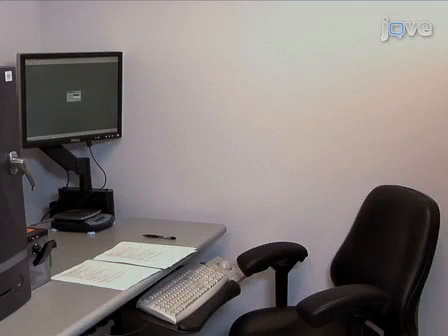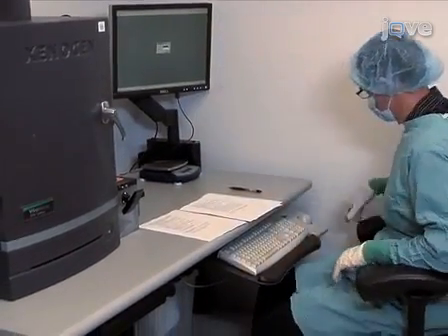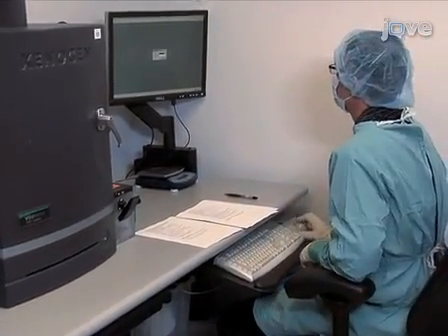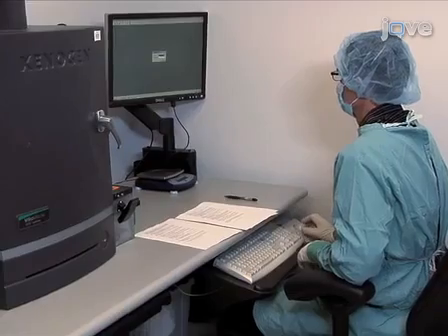Beginning 1 week after the tumor cell injection, quantitative bioluminescence imaging, or QBLI, should be performed once or twice a week. Here, QBLI is conducted using the IVIS Lumina imaging station and Living Image software, version 3.2.